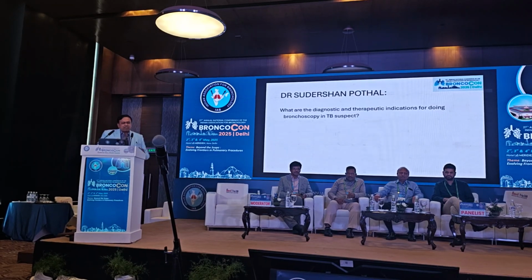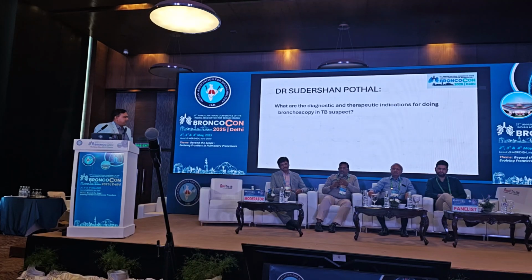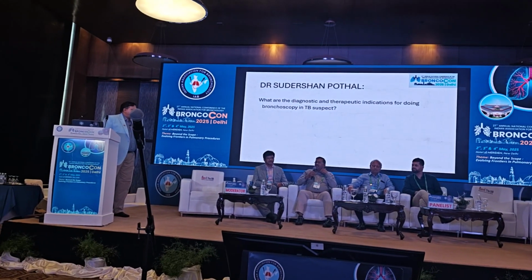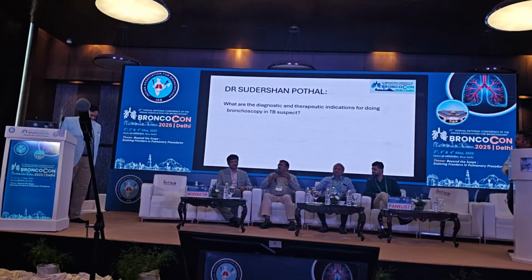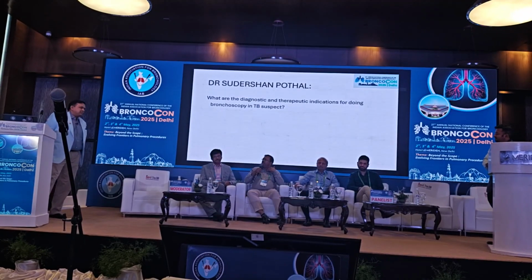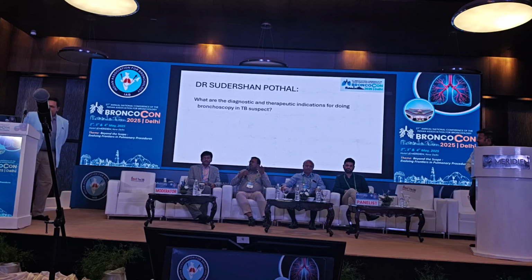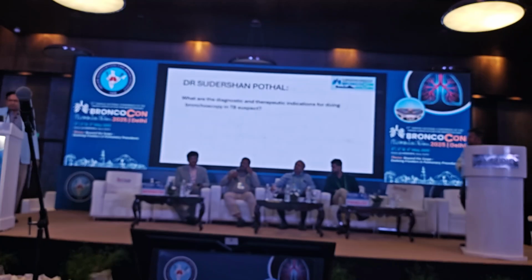Dr. Sudershan, can you just let us know what are the diagnostic and therapeutic indications for doing a bronchoscopy in TB patients? Thank you, sir, for the question. First of all, basically, we do bronchoscopy with regard to tuberculosis, which comes mainly as diagnostic. It could be through flexible bronchoscopy or rigid bronchoscopy. For the purpose of diagnosis, mainly we are interested to take the sample. Say, for example, we suspect tuberculosis clinically or radiologically. In that case, we want to take some BAL or bronchial wash or aspirate.